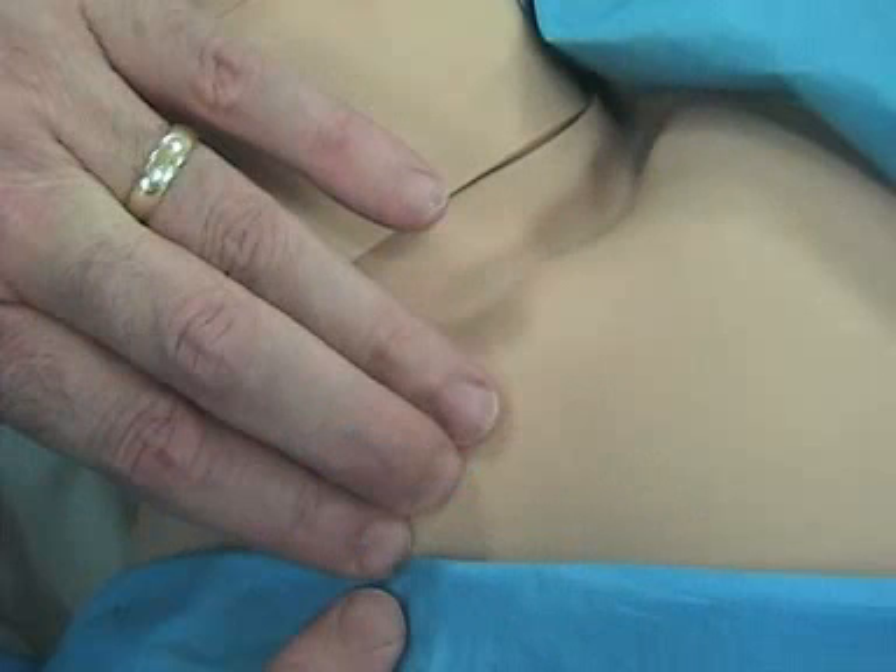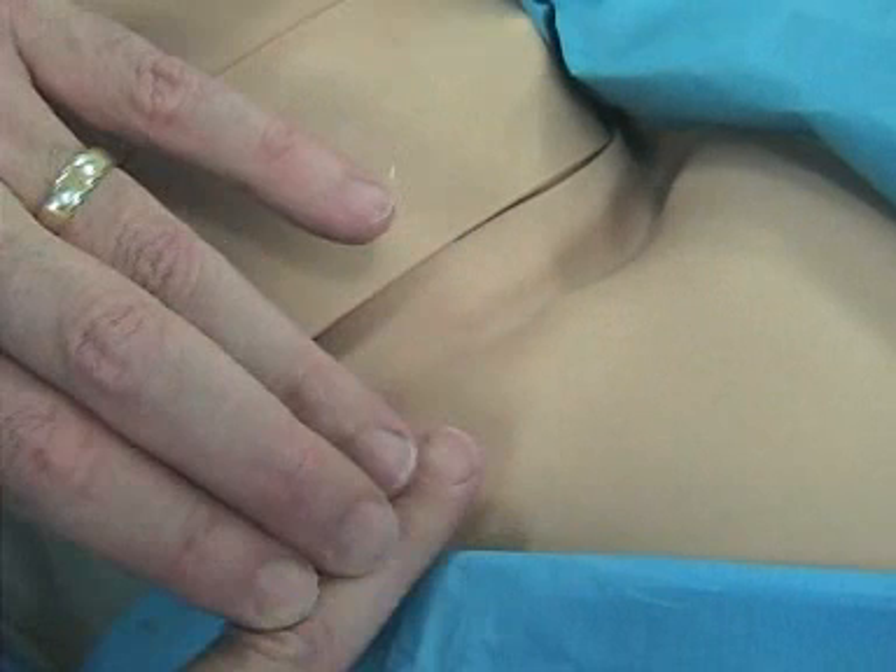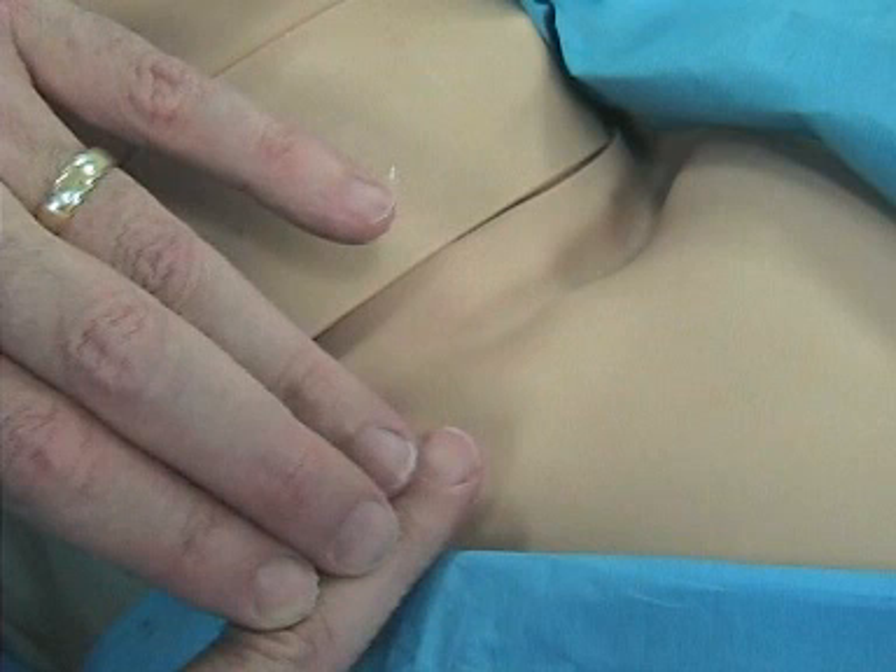I'm demonstrating that my finger is going to hit the clavicle and slide underneath it. My three fingers are going to push the needle down, always keeping it parallel to the patient. The idea is to never have that needle diving down into tiger country. You always want to make sure it's nice and parallel — that way you avoid getting a pneumothorax.